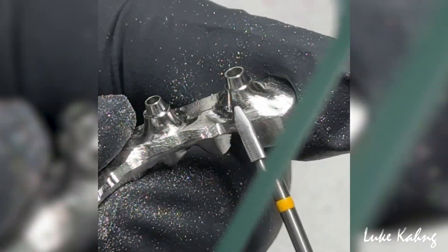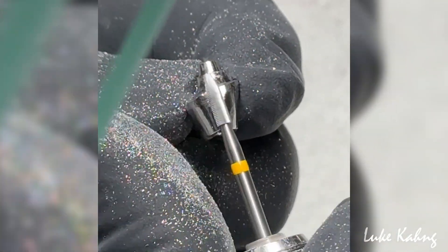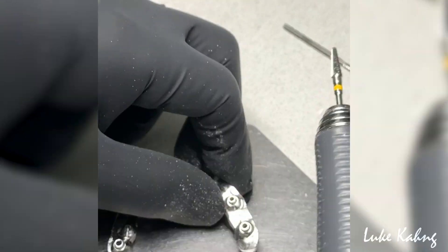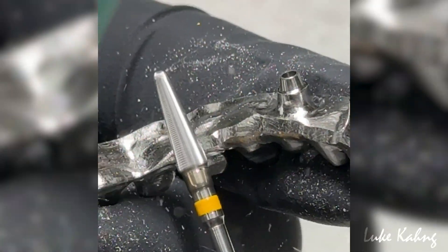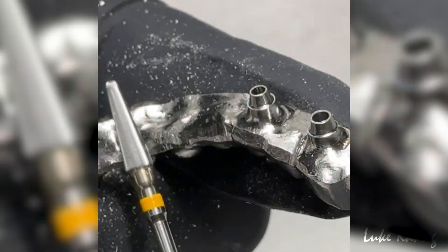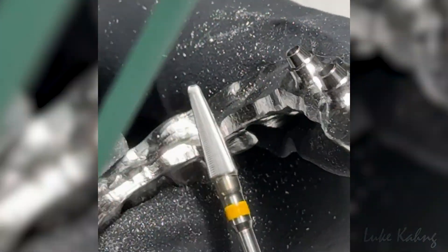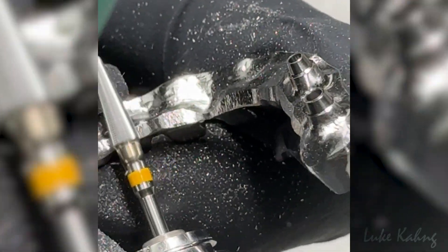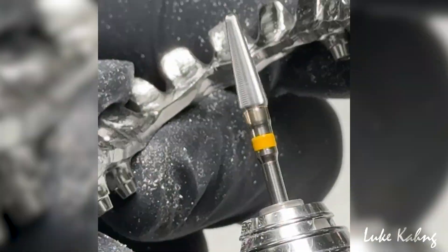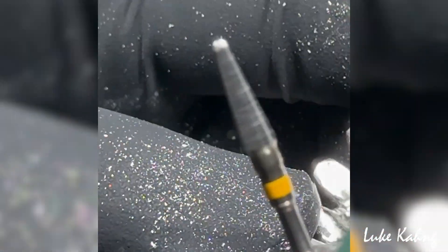I don't need this here either. I'm going to change the ball. Too fat design — make it as thin as possible. I'm going to change the ball and continue adjusting here. It's pretty cool.